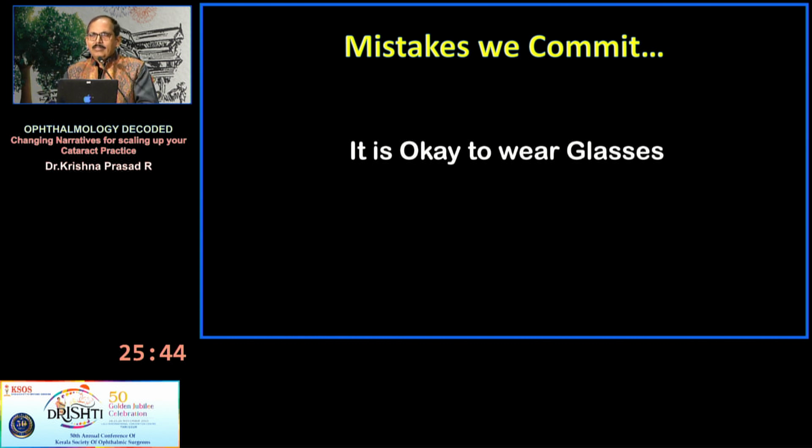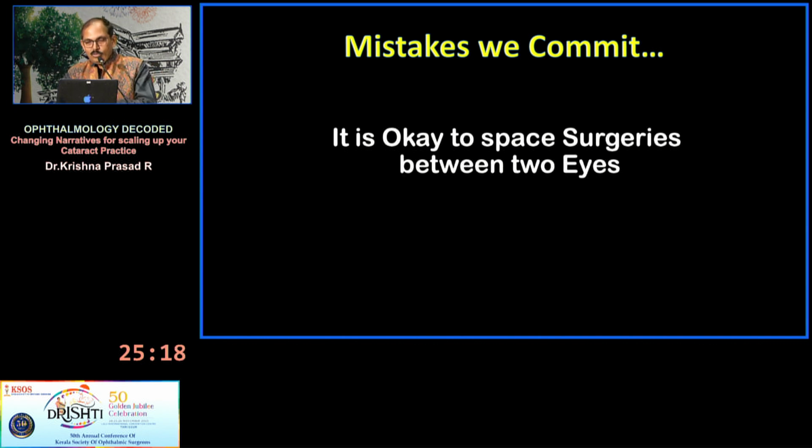The spectacle independence has always been linked to the elite, has been linked to the rich. No, every patient, if they are able to see far and near and intermediate without glasses, it is a great quality of life enhancer. So this is where we have to work on presbyopia correcting IOLs and the toric counterparts, where we need to make the patient emmetrope and spectacle independent. So this is something that we need to work on.